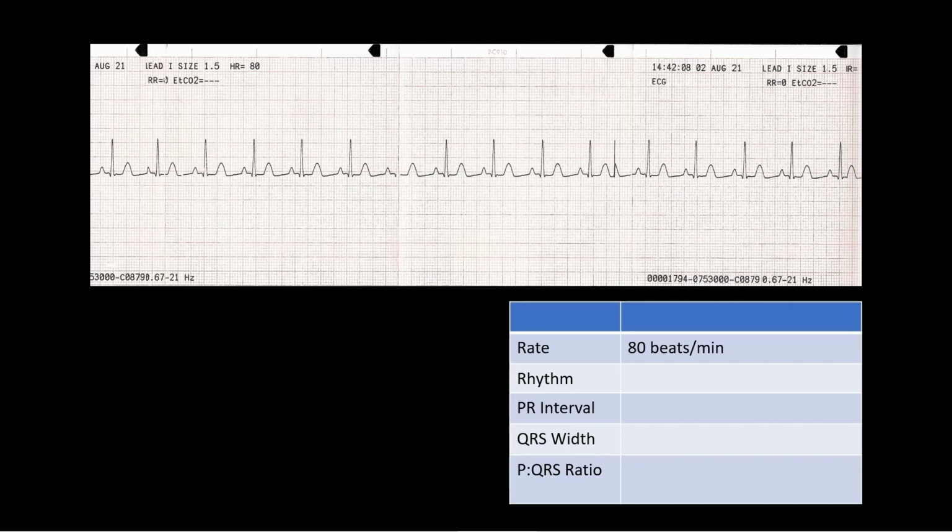If we had a piece of scrap paper, or you could probably pause the video now and put a piece of scrap paper up to your monitor and mark these 2, and then again, look at the gap between the others on the strip. Seems to be pretty consistent intervals. Since the interval appears to be nice and consistent, we're going to say that this rhythm is regular.